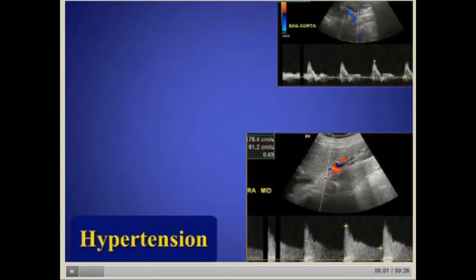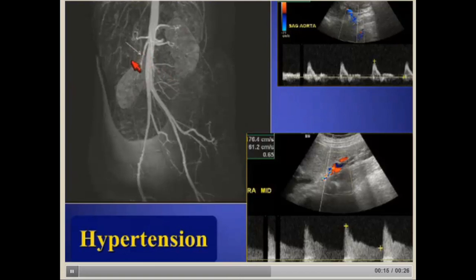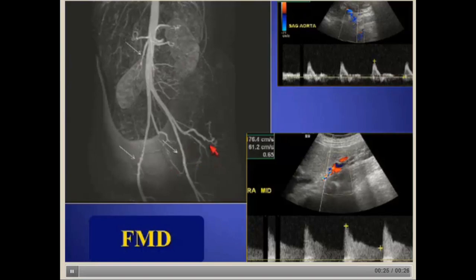Here's a patient where stenosis is seen in the mid-portion of the right renal artery — what does that make you think about? Fibromuscular dysplasia. This young lady with progressive hypertension shows a beaded appearance in the mid-portion of the right renal artery. You can also appreciate areas of FMD involving both common and external iliac arteries.